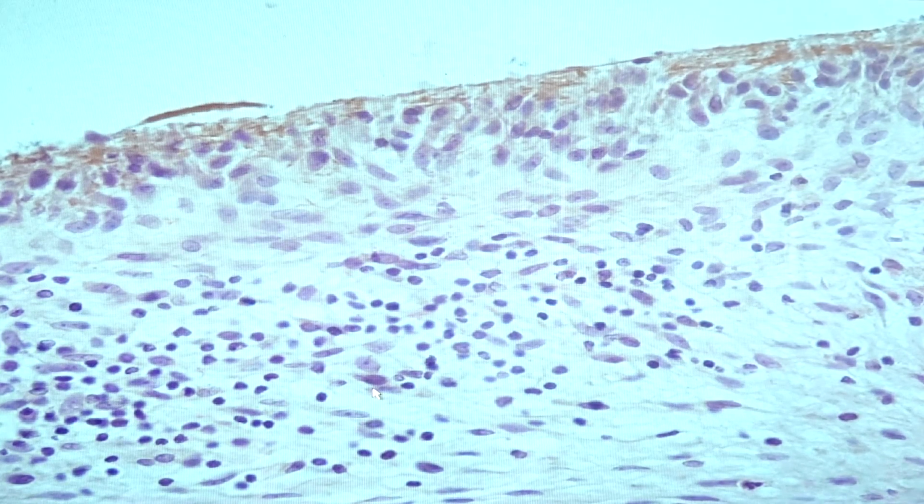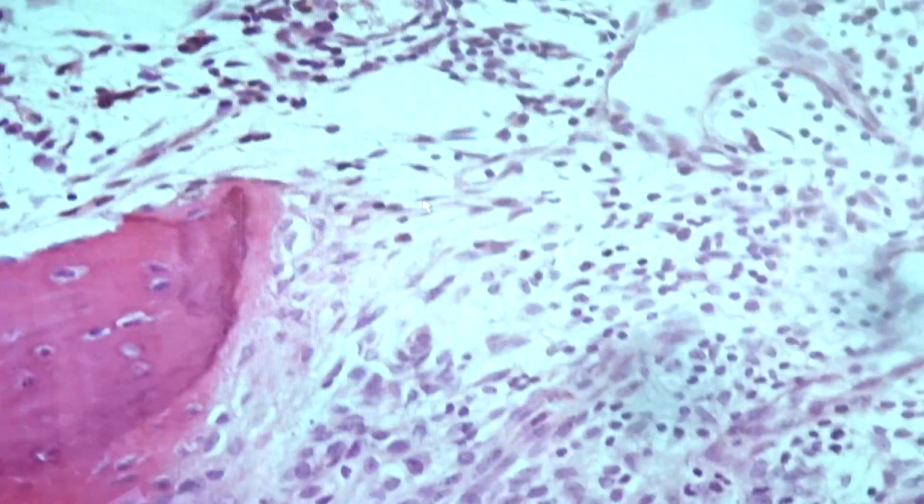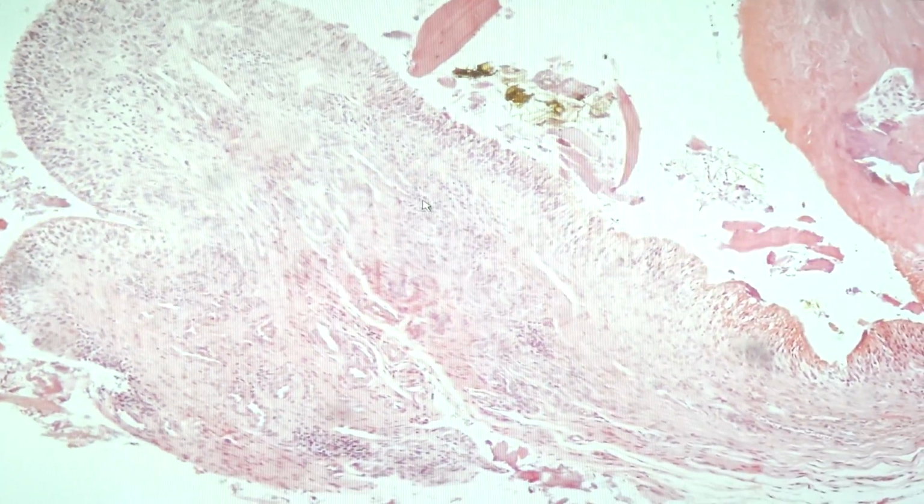And lastly, we have the RANKL, so you know the function of the RANKL. It causes bone resorption, which we would see in this particular area. So in this case, we would see inflammation, chronic inflammation at that. We have a mixture of mononuclear cell infiltrates, histiocytes. And then what is very, very significant in this case would be this portion.